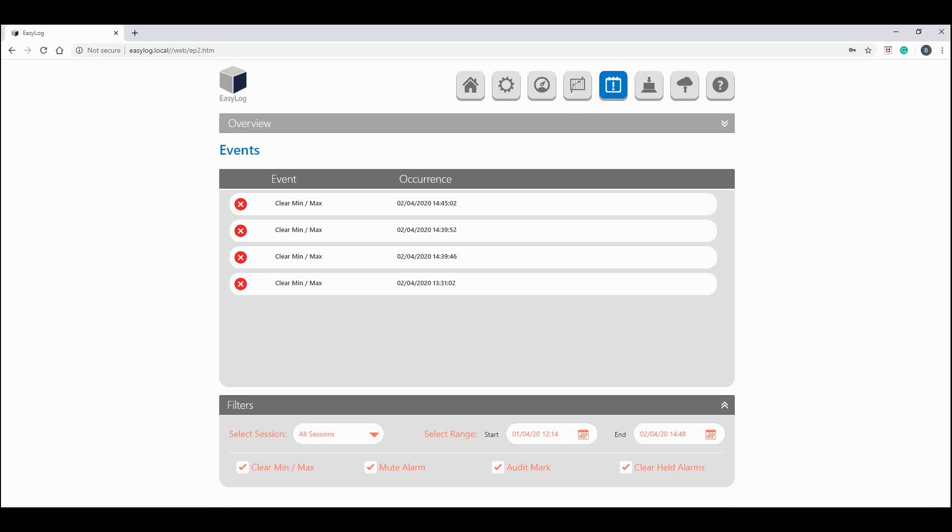The audit mark can be used to identify that somebody has checked the values of the logger. In some applications it is necessary for sensing devices to be visited periodically and physically checked by the user. An audit mark is created automatically whenever a user loops through all channels on the device. The audit check function records these checks which are then displayed in this chart.